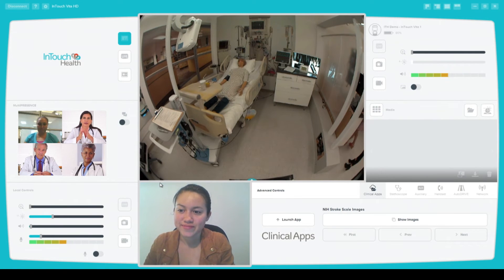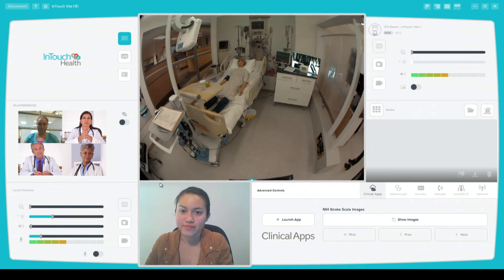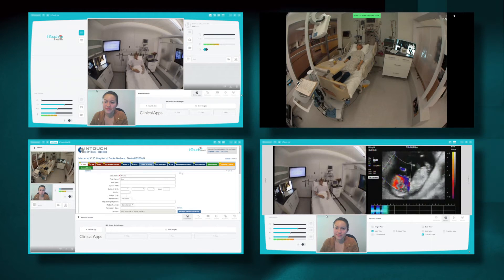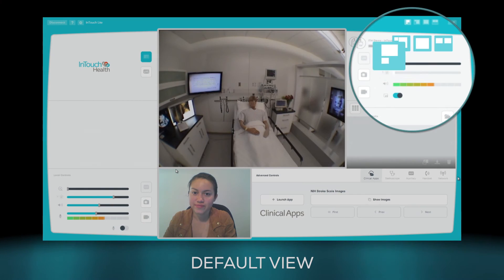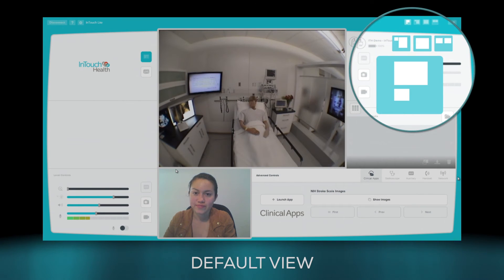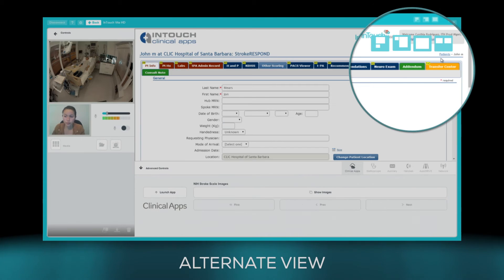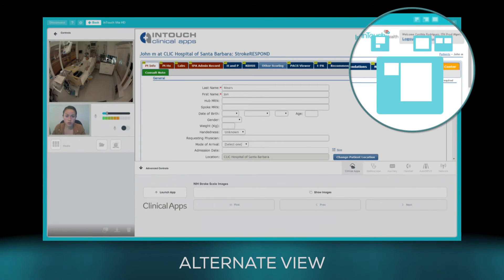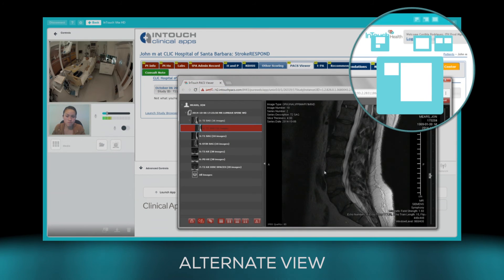Now you can see more multi-presence users on your screen at the same time. There are four different views, including the default view where you have access to all the controls, and the alternate view used to consult while updating patient records and referencing radiological studies.